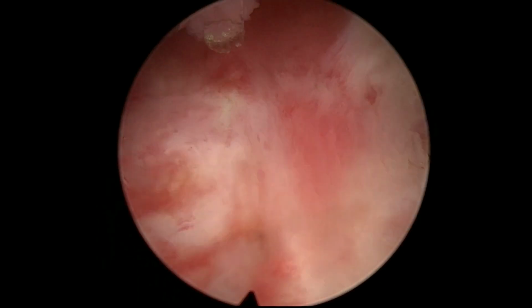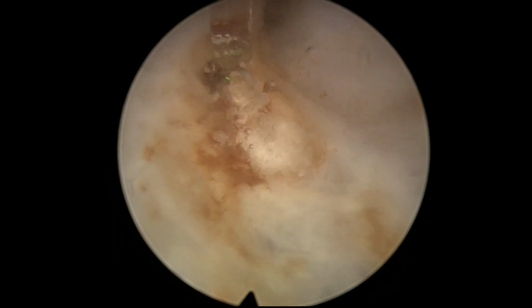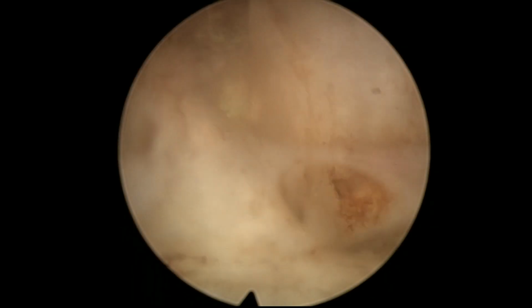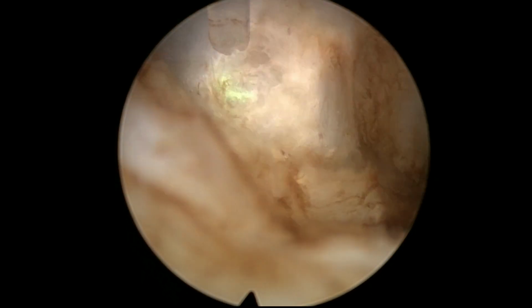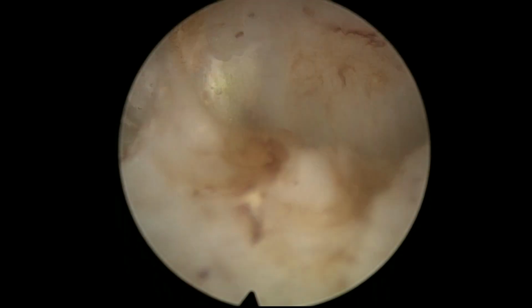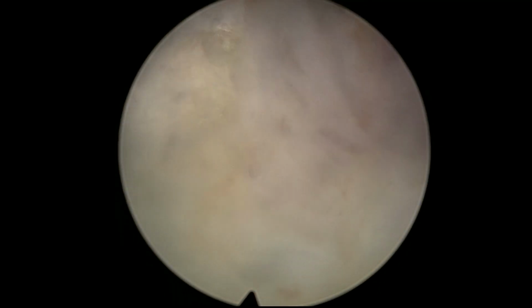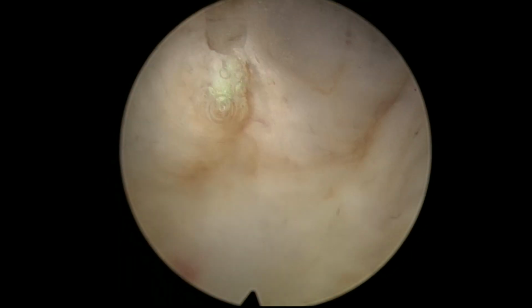I think the fact that we're going around the adenoma following this line, which was performed at the right depth, and the fact that we are analyzing feedback from the screen all the time to check if there is adenomatous tissue left or not, I think with experience one can do a very nice anatomical enucleation even when the plane is not perfectly patent or visible. So here you probably will agree with me that the tissue is a little bit coagulated or fused, or there's some effect that is not allowing us to see the beautiful glistening surface of the capsule. But this also happens with Moses and virtual basket.